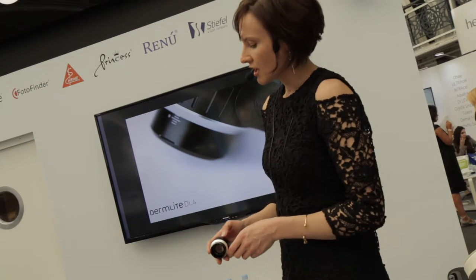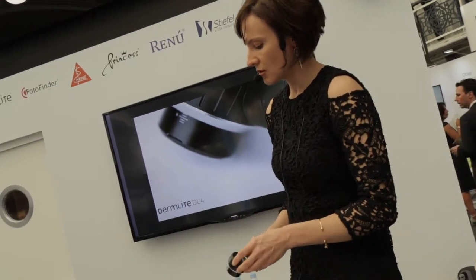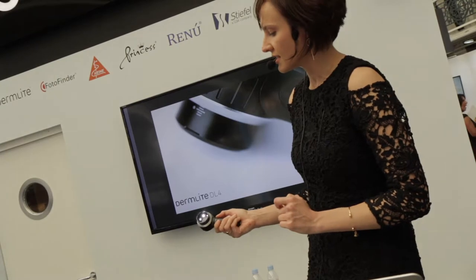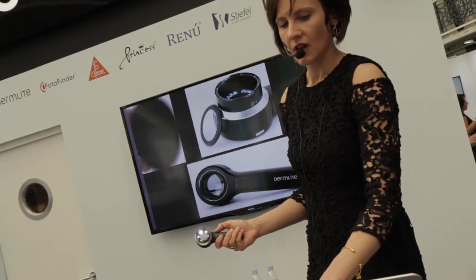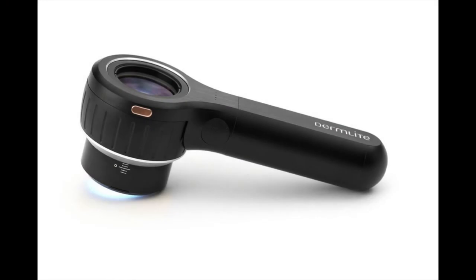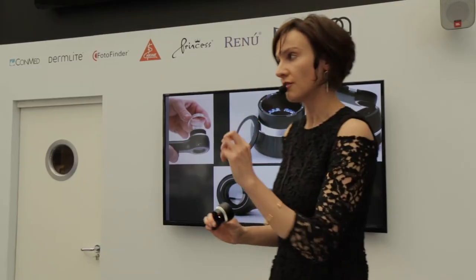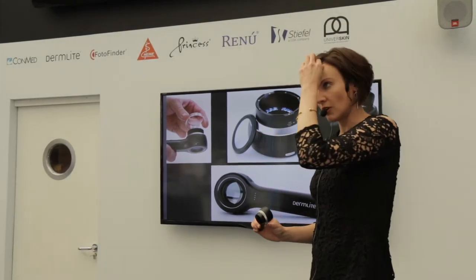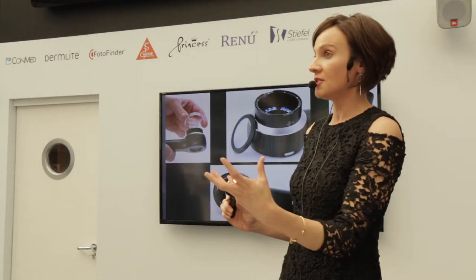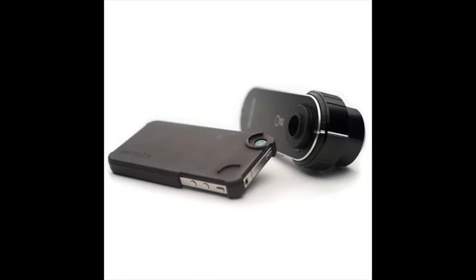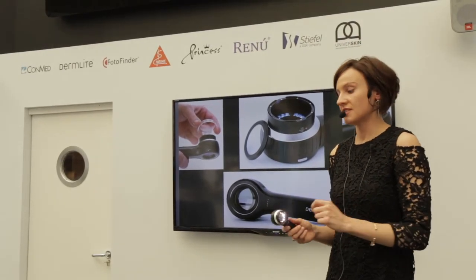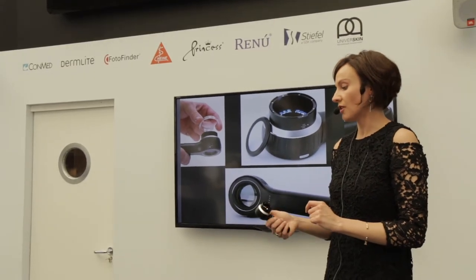Coming back to looking at pigmented lesions, we've got two different types of high-quality LEDs — these are exceptionally bright. We've got a polarised and a non-polarised setting, which you should be able to see here. We've also got a pigment boost, which is a trademark setting for this device, meaning you can look at things like the stroma in much more detail. When I've compared pigmented images of even benign lesions using standard dermoscopy versus this, I can really appreciate the clarity and detail in the pigmentation in much greater detail. It's a really unique add-on I've not come across previously.